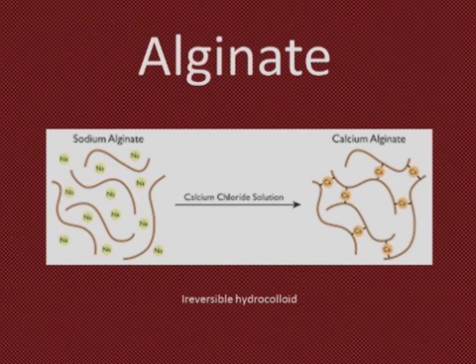The powder contains sodium alginate, calcium sulfate, trisodium phosphate, diatomaceous earth, zinc oxide, and potassium titanium fluoride. Upon mixing this powder with water, a solid is formed. The chemical reaction taking place involves sodium alginate reacting with calcium sulfate, replacing the sulfate and alginate respectively. This results in sodium sulfate and calcium alginate. This reaction occurs too quickly during mixing or loading of the impression tray, and so is slowed down by trisodium phosphate and other diluents in the mixture.